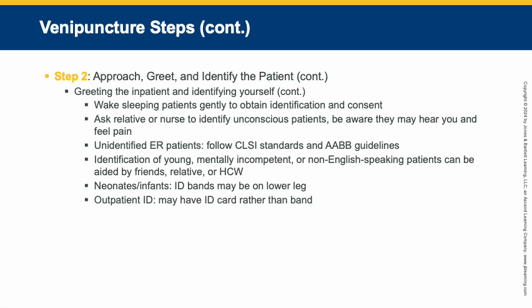Okay, it's not a chart, but on page 263 in your textbook, figure 8-7, I do want to show you this. This is an example of a special 3-part ID band used for unidentified emergency room patients. Okay, you see how it doesn't have the name?